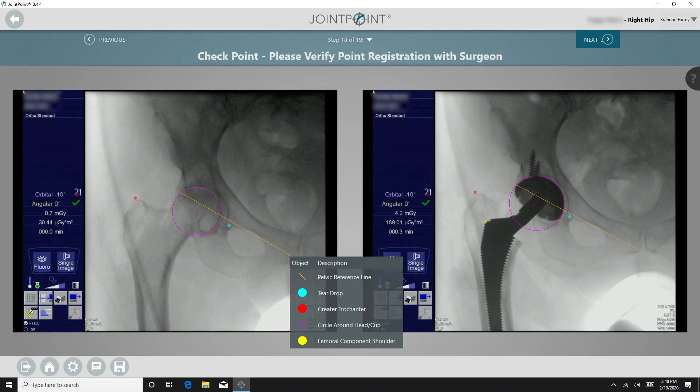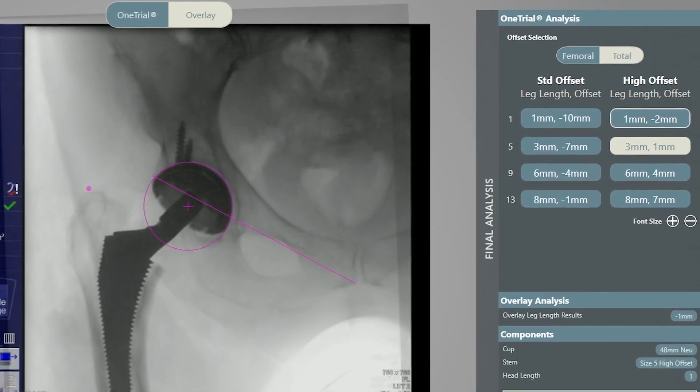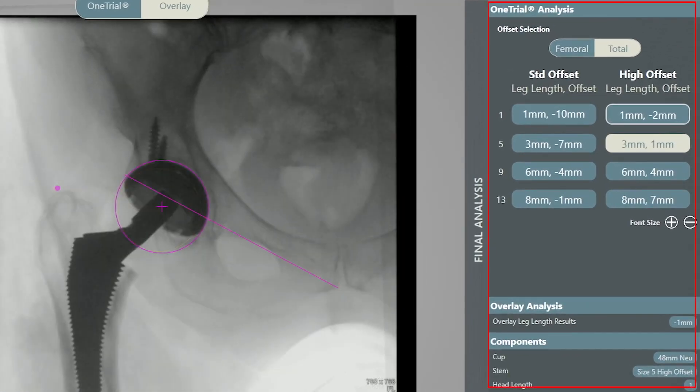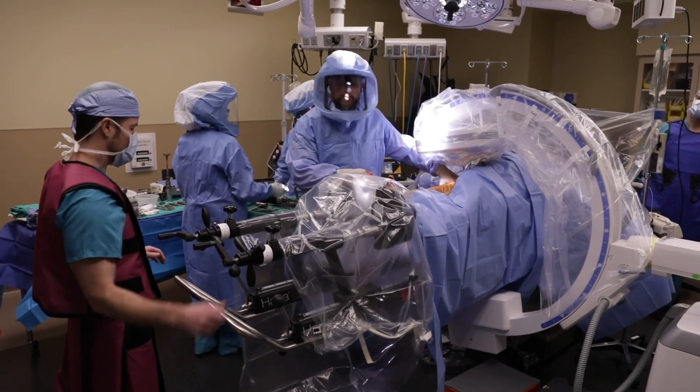You then align the femurs and confirm using an overlay. Point registration is verified with the surgeon. The One Trial Analysis gives the surgeon the option of adjusting leg length and offset based upon implant modularity relative to the patient's anatomy.